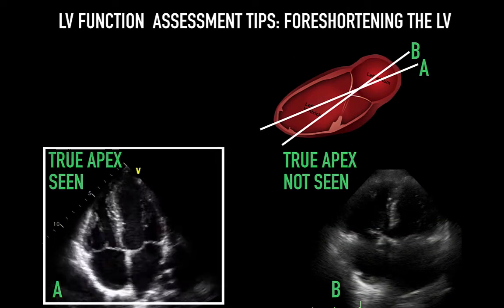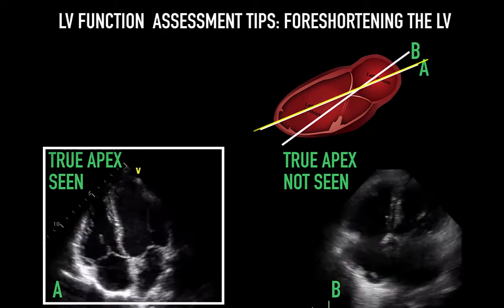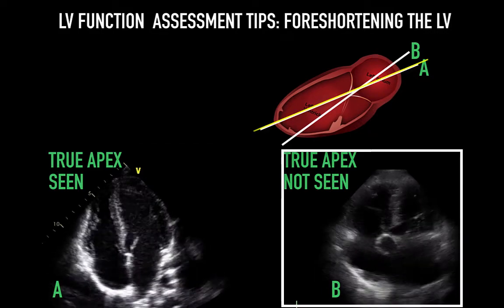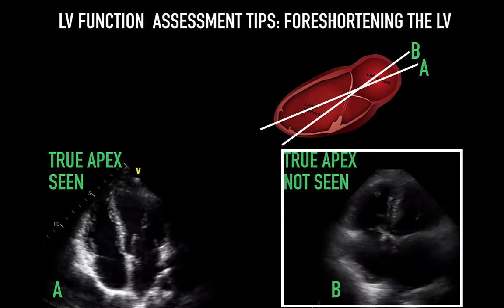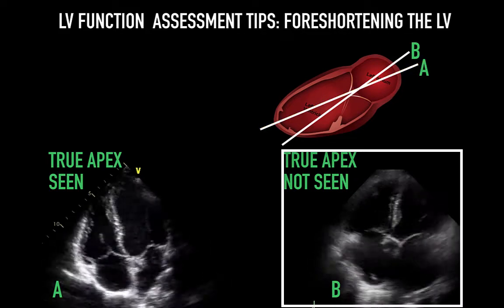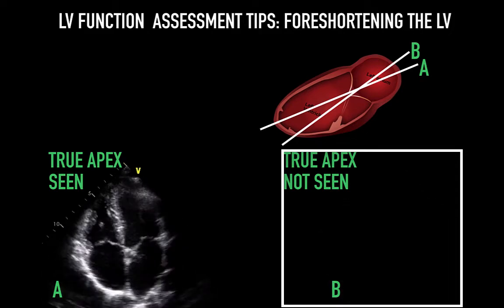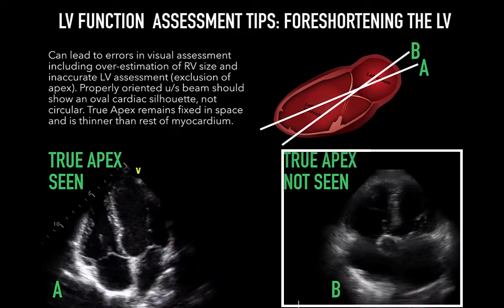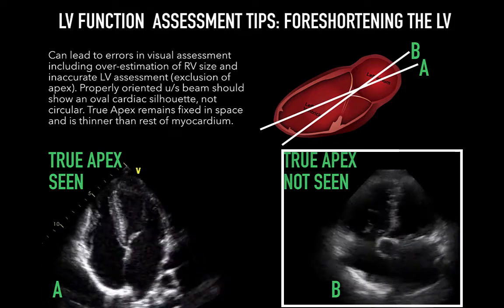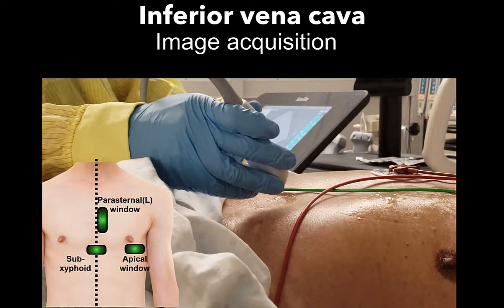Be careful to obtain your apical four-chamber long axis through the LV apex, or your view will be foreshortened, which means you will alter the appearance of your left ventricle and right ventricle. Often the apical four-chamber will look more spherical. Image B on the right corresponds to the foreshortened view, where the imaging plane cuts through just below the apex.